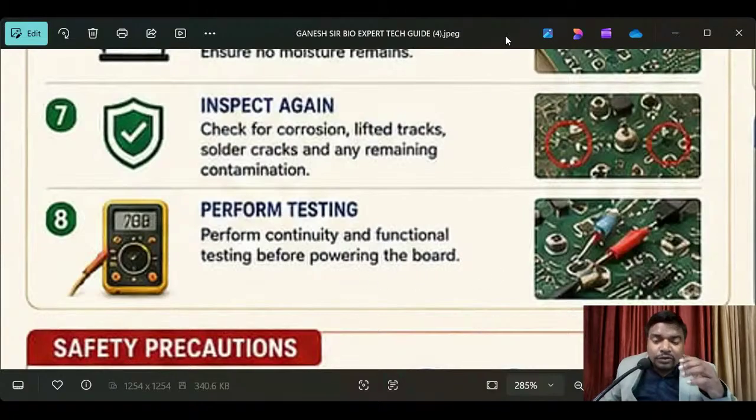First of all, before checking the PCB, take your multimeter. Without doing anything else, just take all the parameters. Note what components are placed on the PCB. Then, using your multimeter, take a paper and go from this circuit to this circuit. This is circuit one, you can keep a name. Then this circuit is okay, this circuit is okay, right?